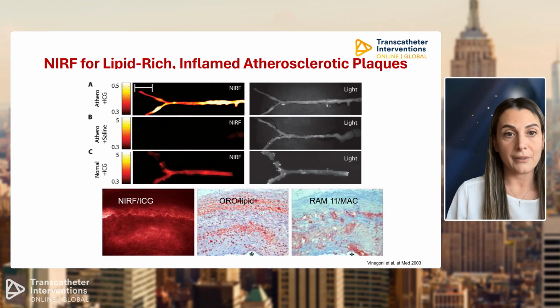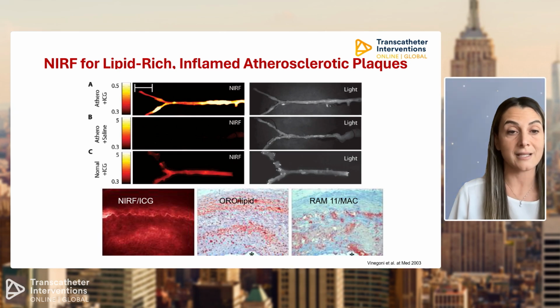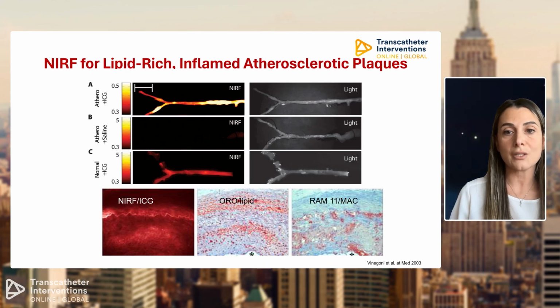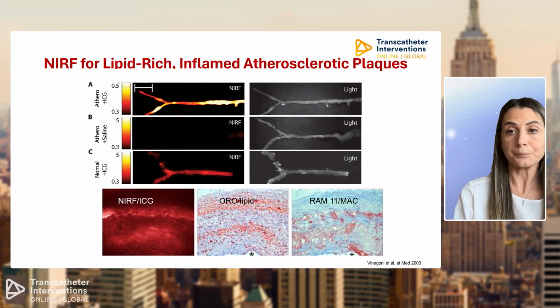And this is something new, a new frontier, NIRF, to identify inflammation. So near infrared fluorescence is now at a research level, but the point is to investigate what the level of inflammation at a plaque is.